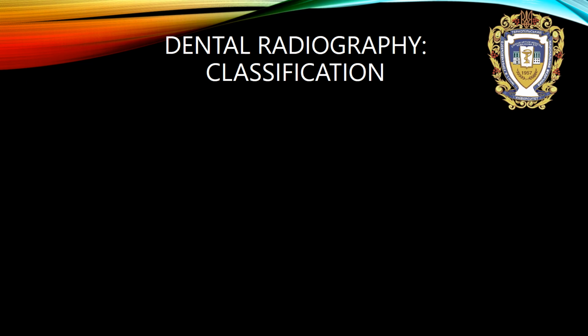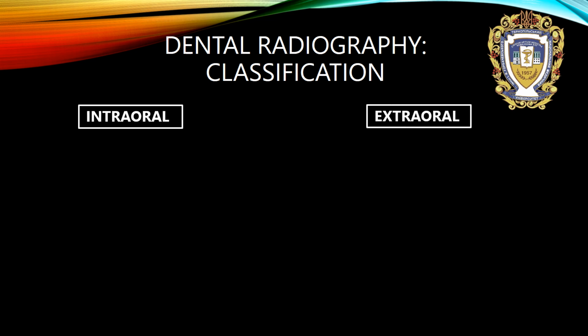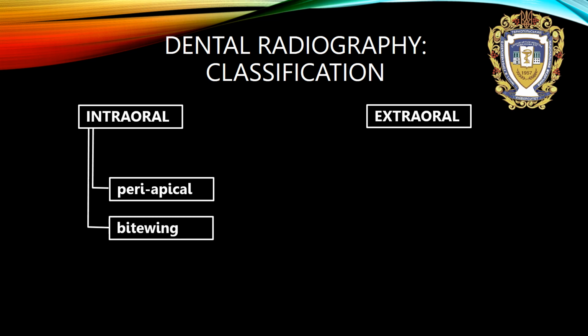Classification of dental radiography. As I said earlier, all dental radiographs are divided into intraoral and extraoral. Intraoral X-rays are divided into periapical, bitewing, and occlusal.